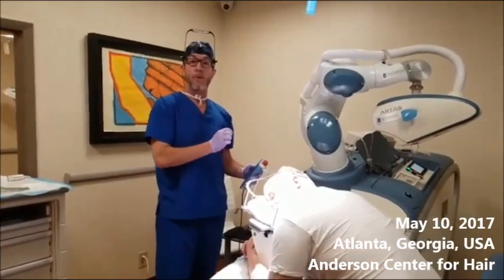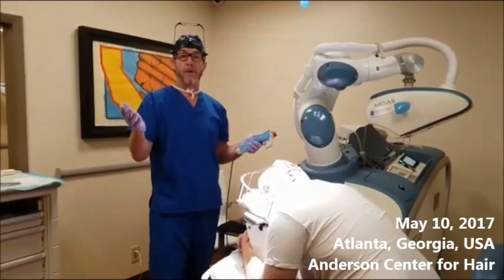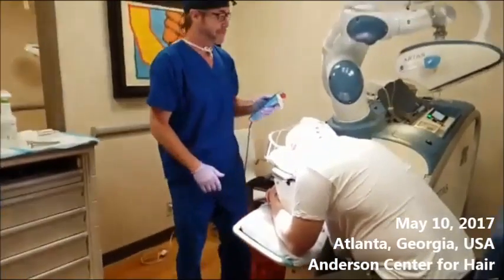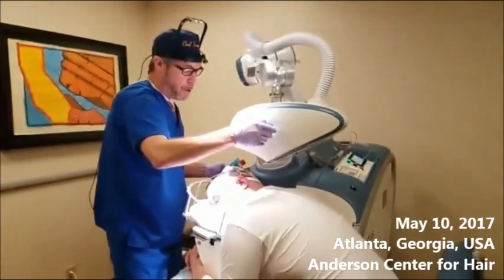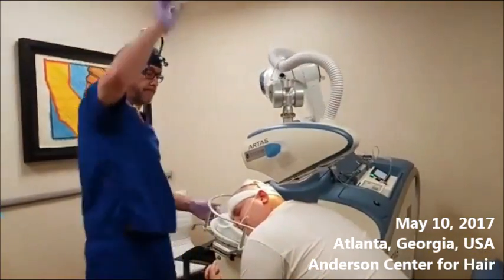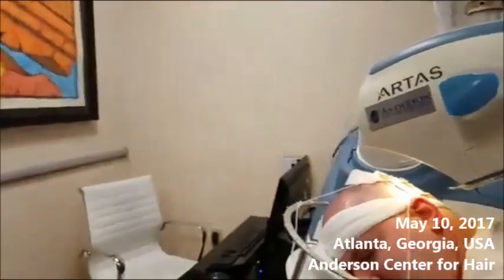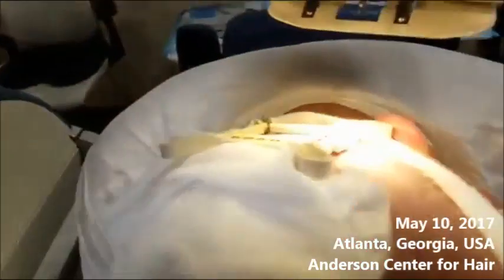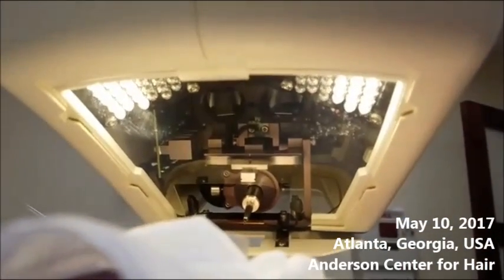We've got the 19-gauge 0.9-millimeter punch on there today. I know there's been some chatter on the Internet about huge punches — I don't know who considers 0.9 millimeters huge, but he's probably about that high. So we're going to bring the robot in here, and it's going to orient itself. We've got the robot all centered on Charles's head, specifically on the tensioner. And if we look up under here, we can see the two stereoscopic cameras right in the center of the screen — they're looking at us and they're going to examine these hairs surgically and remove them.